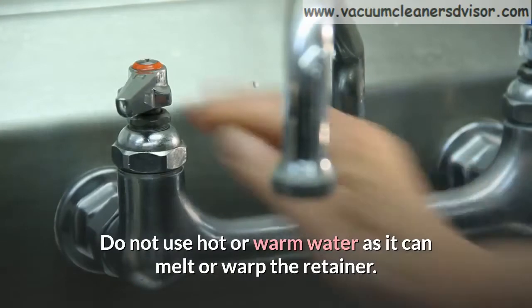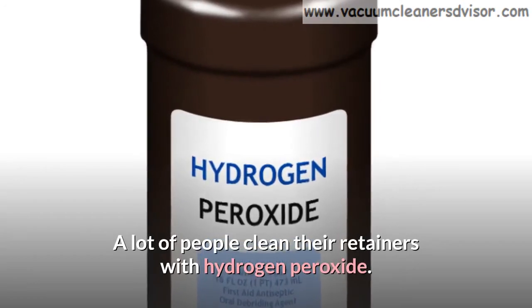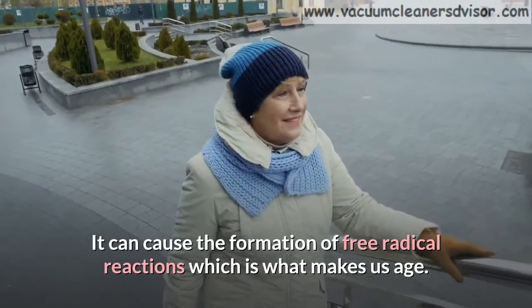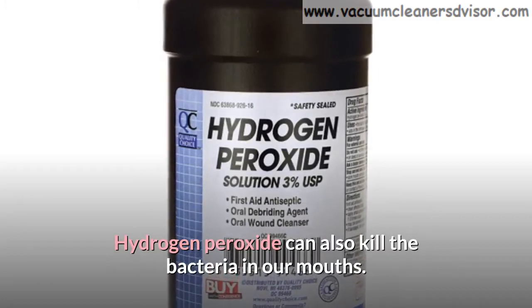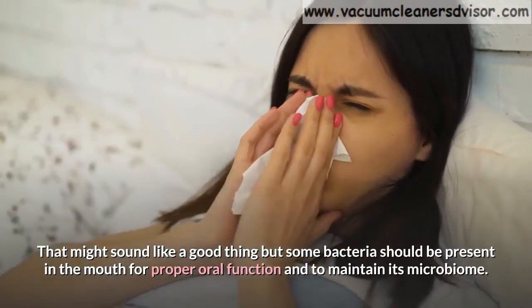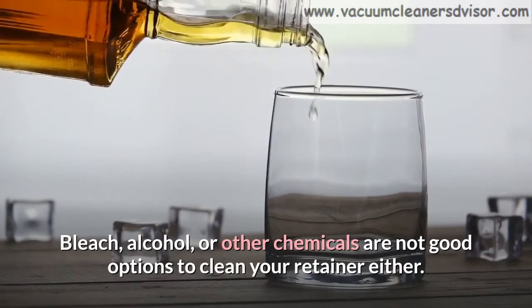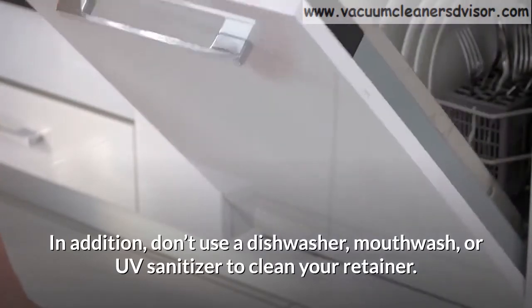Do not use hot or warm water as it can melt or warp the retainer. A lot of people clean their retainers with hydrogen peroxide — some use it alone or with vinegar. You should never clean a retainer with hydrogen peroxide. It can cause the formation of free radical reactions, and it can also kill beneficial bacteria in our mouths that should be present for proper oral function and to maintain the mouth's microbiome. Bleach, alcohol, or other chemicals are not good options to clean your retainer either. In addition, don't use a dishwasher, mouthwash, or UV sanitizer to clean your retainer.